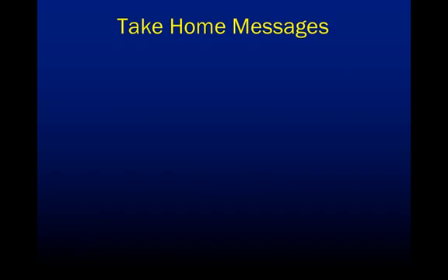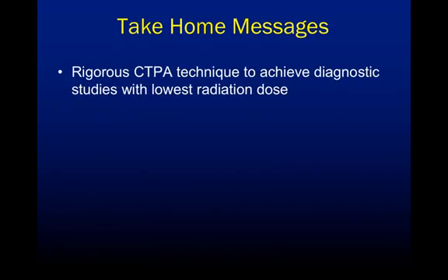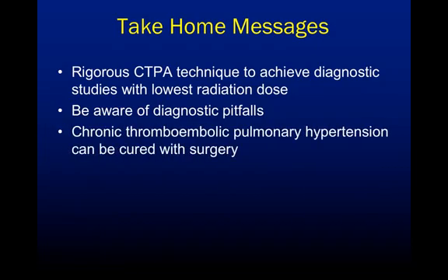So I'd like to leave you with a few take-home messages. Number one, a rigorous CTPA technique is necessary to achieve a diagnostic study with the lowest radiation dose possible. Be aware of the diagnostic pitfalls on CT pulmonary angiography. And finally, chronic thromboembolic pulmonary hypertension can be cured with surgery, so it's a very important diagnosis to make. Thank you for your attention.